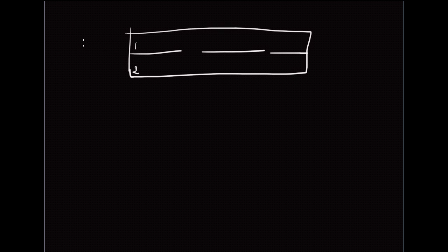Blood flow is through compartment 1 because there's a pressure being applied at this point which is greater than what's at this point. You're going to get fluid to move across. Now that fluid is going to carry with it solutes of all different sizes. Small sizes, some solutes that are a little bit larger in size, and then of course the largest solutes of them all.